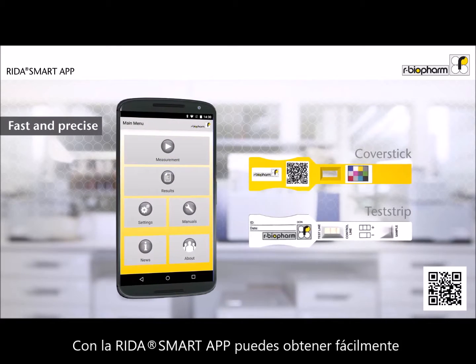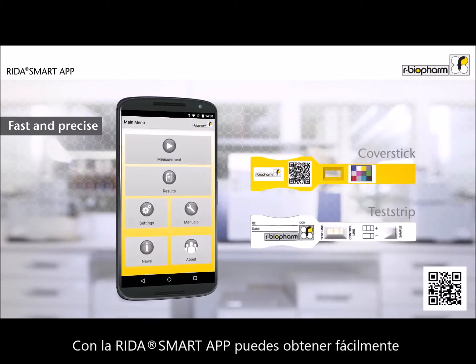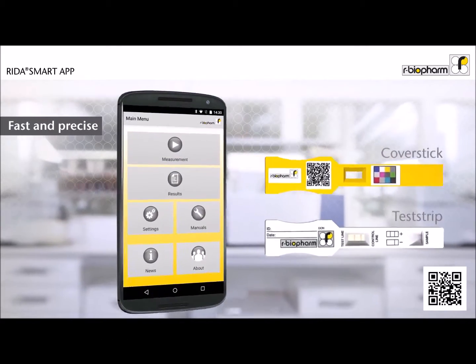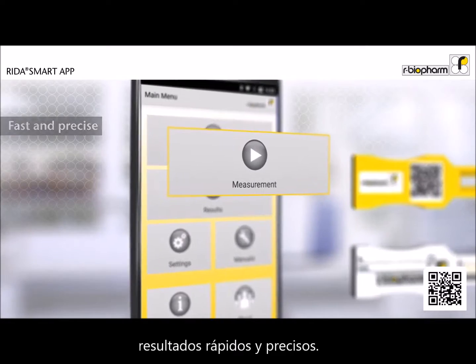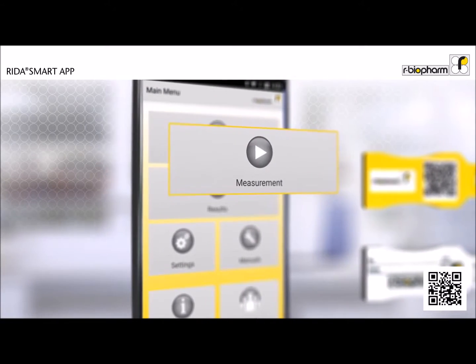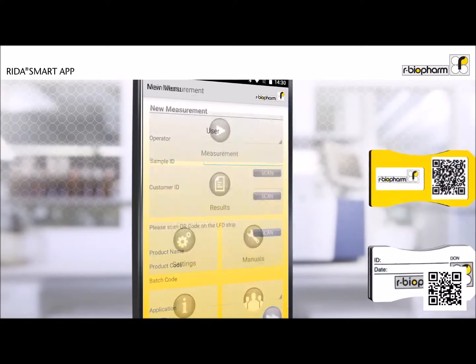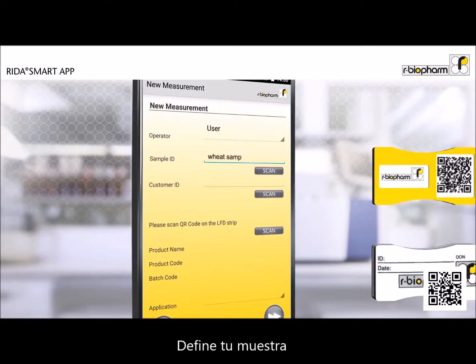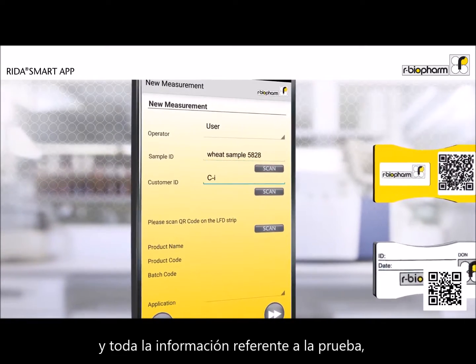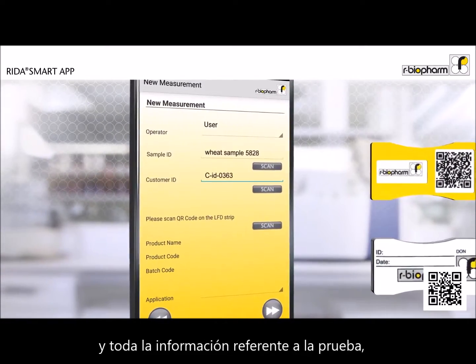With the RIDAR Smart App you can easily obtain rapid and precise results. Define your sample and all relevant information for the test.